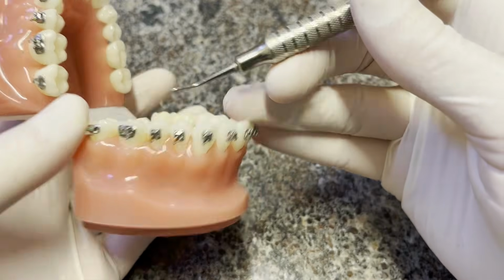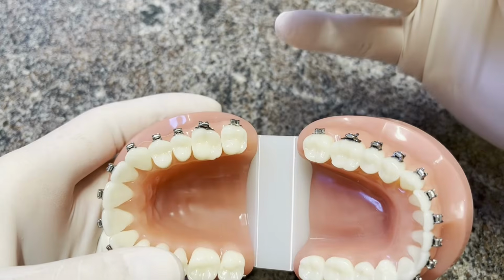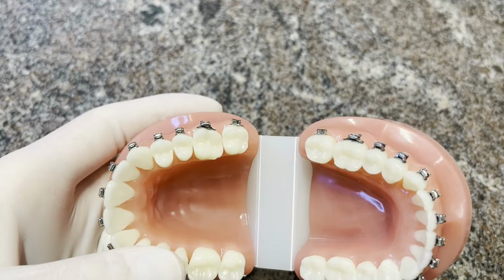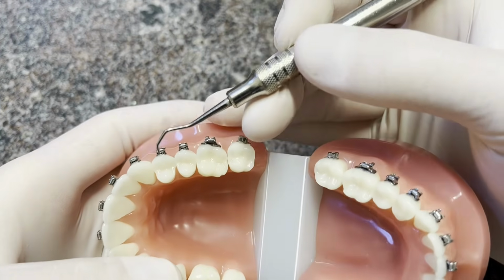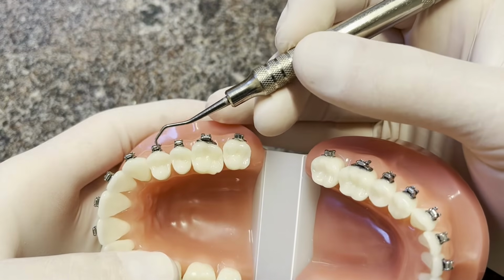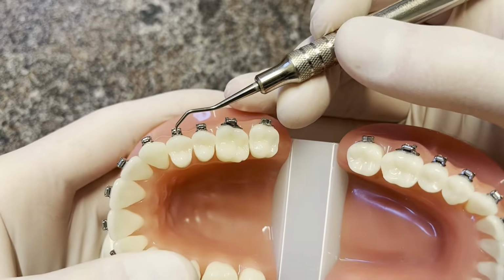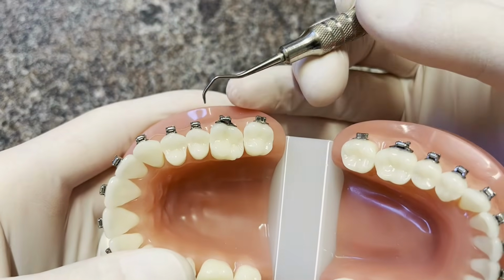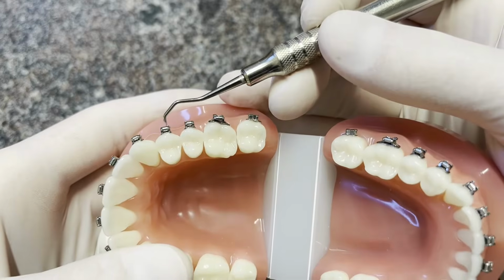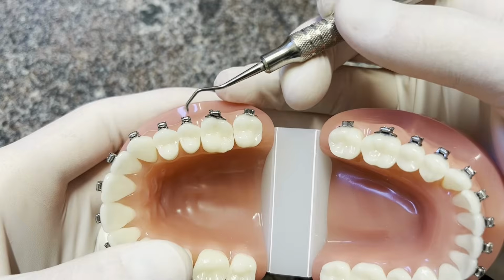So then premolars, you'll notice when you look at a premolar, it'll have kind of a swell to it, like a height of contour as it's called. Think of it like the back of a horse, and then you want this to sit like a saddle, straddling or centered on that height of contour. That's rotation. This one is great. This one is a little bit too far to the mesial. It should go back around.